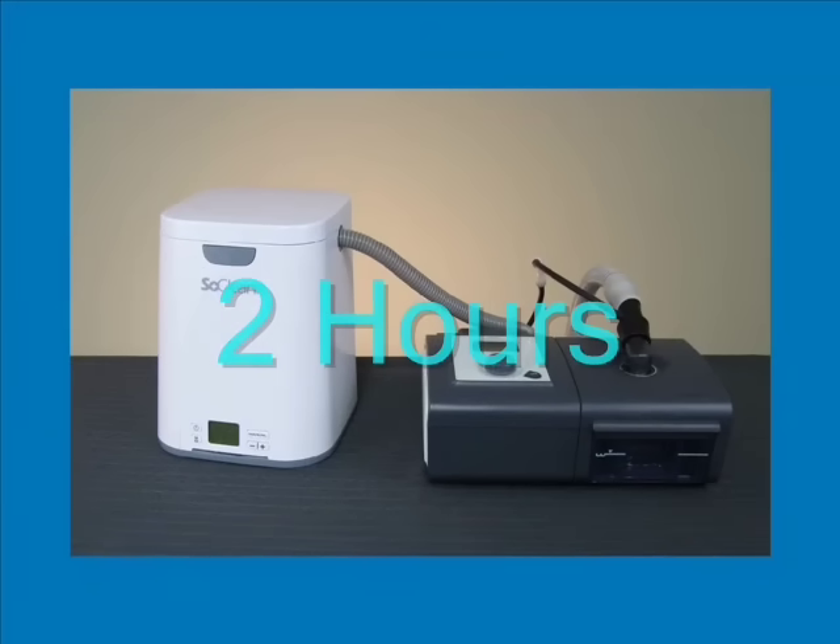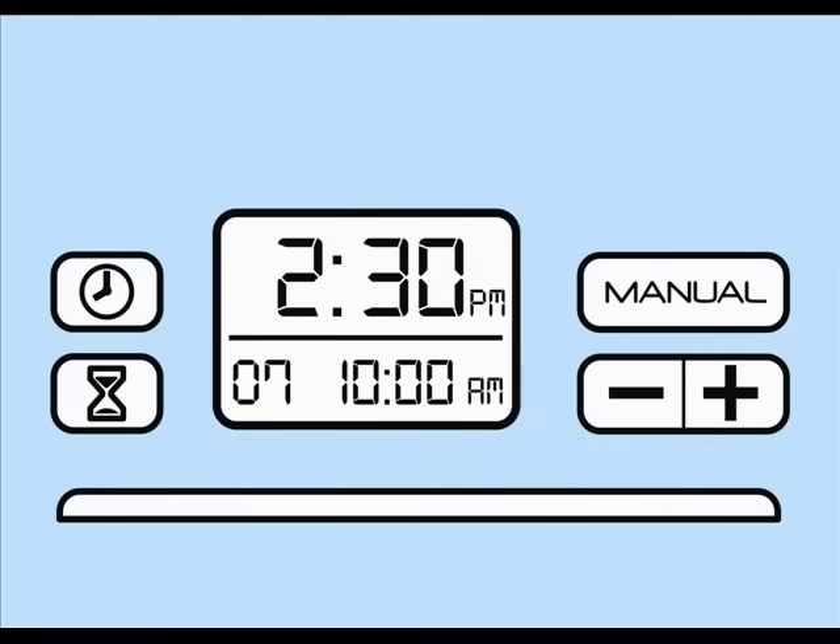To assist you in this, there are colored indicator lights positioned below the clock display. Red means the SoClean is operating. Yellow means the cycle is in its 2-hour waiting period. Green means that all sanitizing is complete and your mask can be removed.